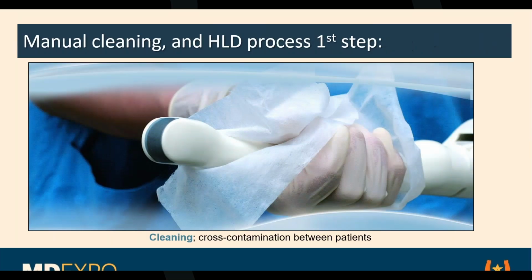And Mark, I think you'll agree that the whole thing starts with cleaning off the macro level stuff. It has to be done before you put it into an automated disinfecting device. You blow up the automated device and it'll just be a train wreck. So there's no such thing as 100% automated, because you still need to do that macro cleaning of the probe, whether it's in the room where the sonographer is putting it into an automated disinfector, or if it's in the surgical suite for a transesophageal, clean off stuff.